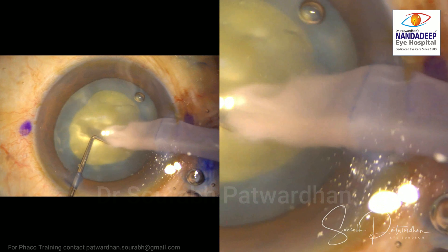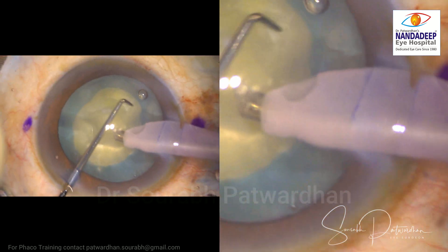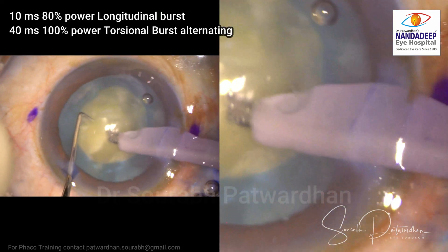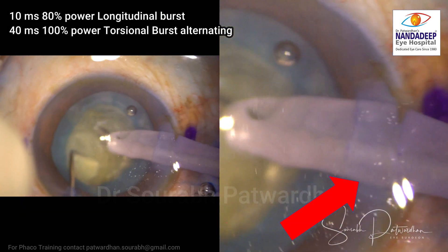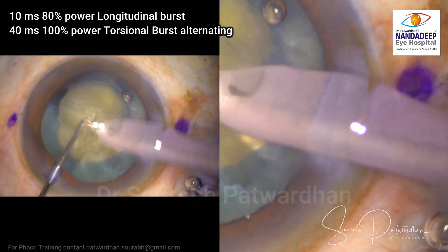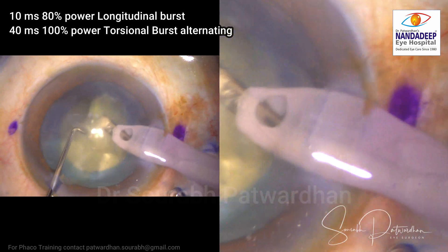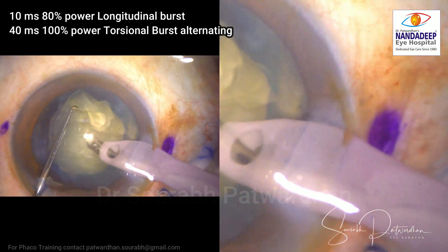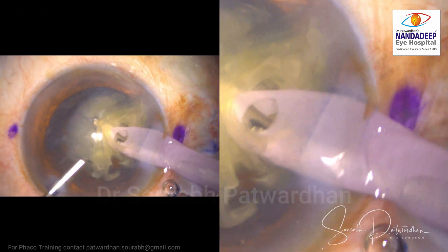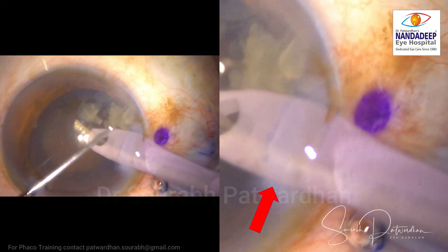My focus here is on dividing the nucleus into pieces. I want you to see what is happening at the incision — you can see the phaco needle inside the sleeve is getting pushed against the incision. At this point it is very tightly connected with one part of the incision as I am focusing on nucleus division, which is happening nicely.